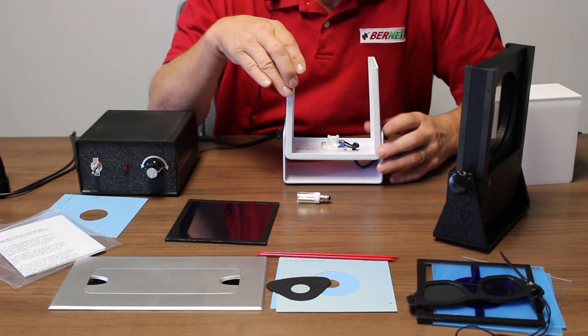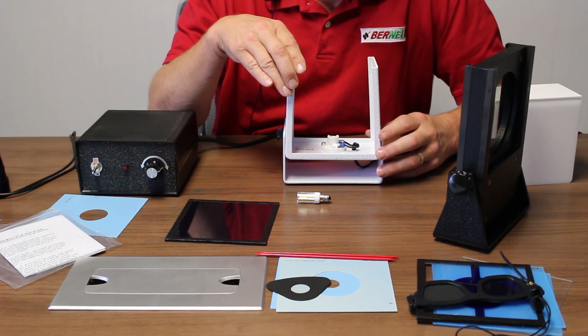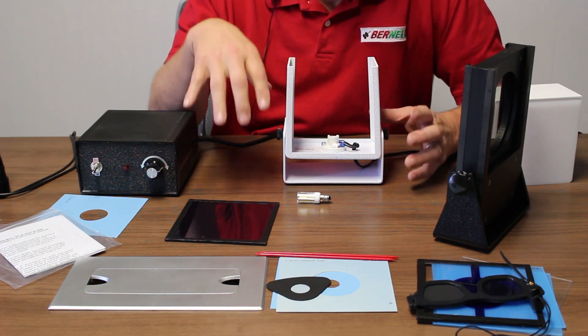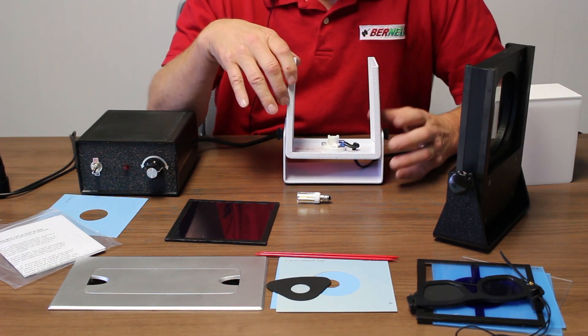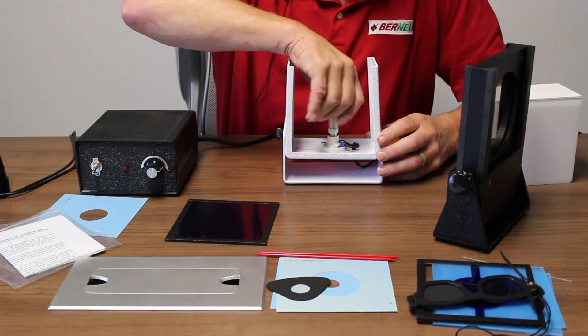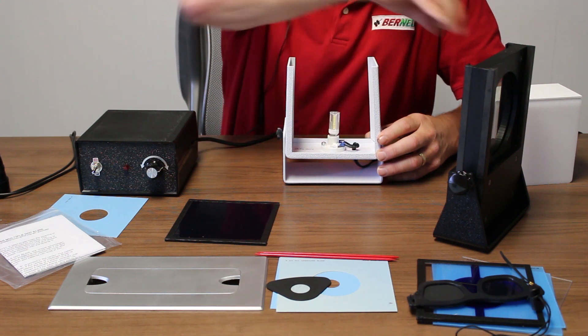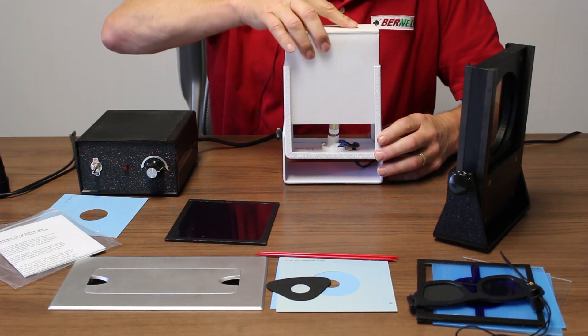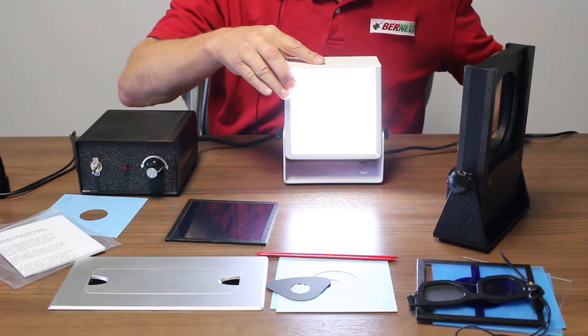Your MIT comes very disassembled so it's packed and shipped safely. One of the first things you want to do is put your light bulb. We now use an LED light bulb. We put that into the assembly so that our light source is ready to go.